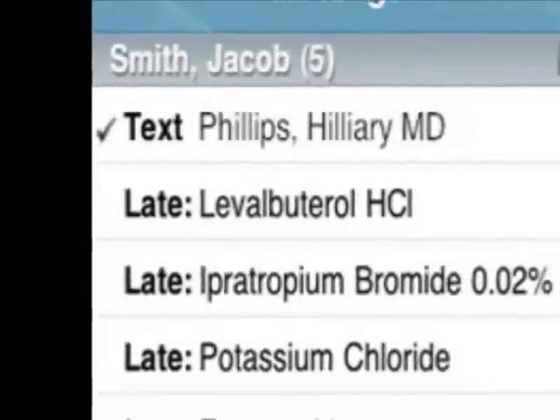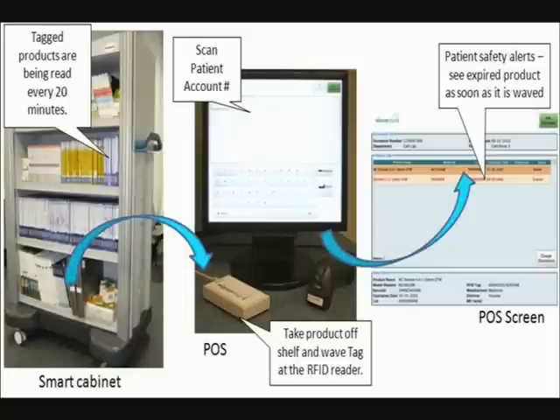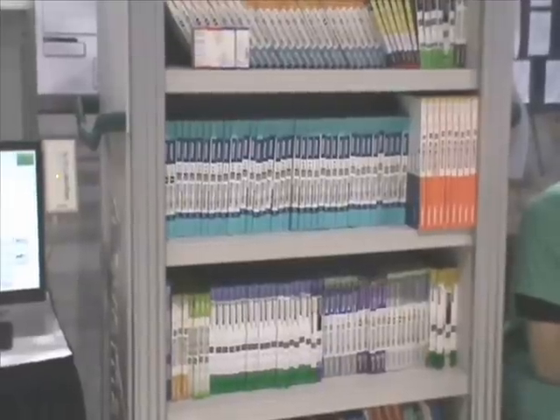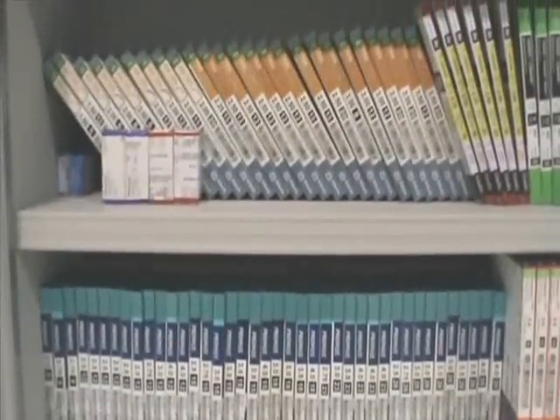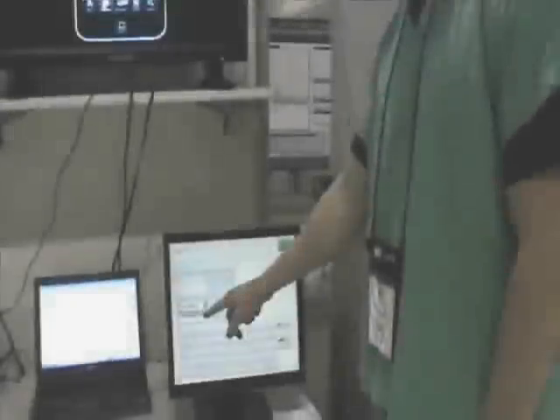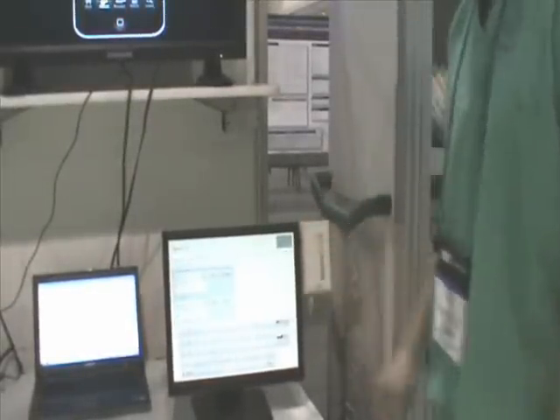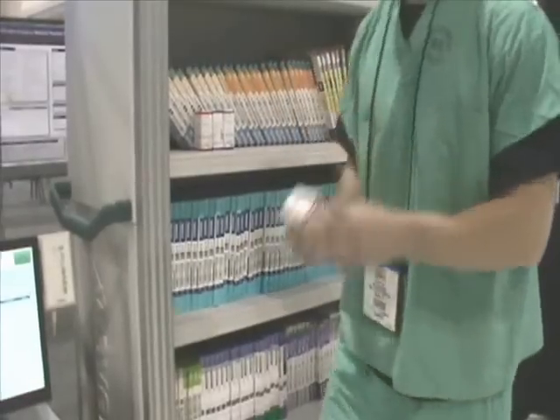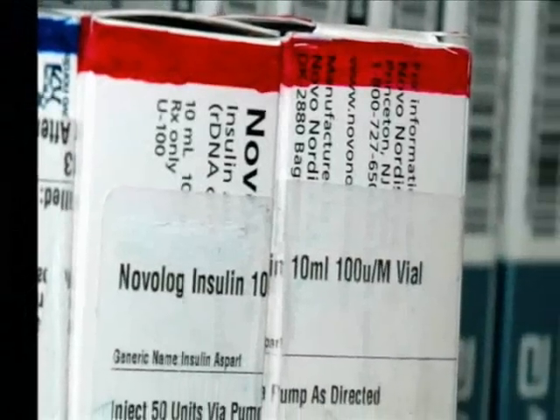This screen shows the care team that there is a new message to review and acknowledge. To fulfill the physician orders, we access the RFID-enabled cabinet where the medications and supplies are located. The insulin has a passive RFID tag attached, and the cabinet is dynamically reading all tagged products in real-time, tracking the contents. Once the item is removed, it is automatically identified as missing in the web-based reports available to administration. We select the patient — already up on the workstation — and wave the product at the point-of-care reader. This changes the disposition from missing to used.